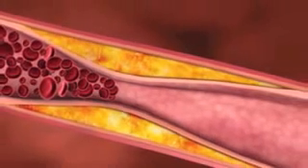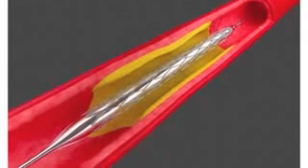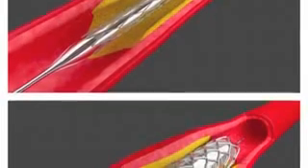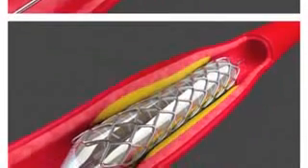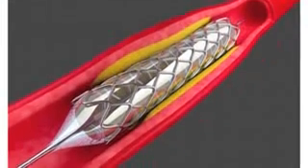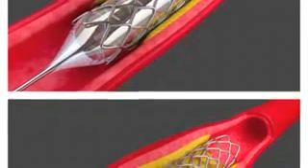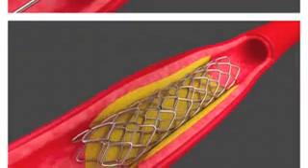During angioplasty, a catheter with a balloon in its tip is threaded to the blocked coronary artery. Once in place, the balloon can be inflated, pushing the plaque against the artery wall. This creates a wider path for blood to flow to the heart. Sometimes a stent is placed in the artery during the angioplasty procedure. A stent is a small mesh tube that, once deployed, supports the inner artery wall and keeps the lumen open.